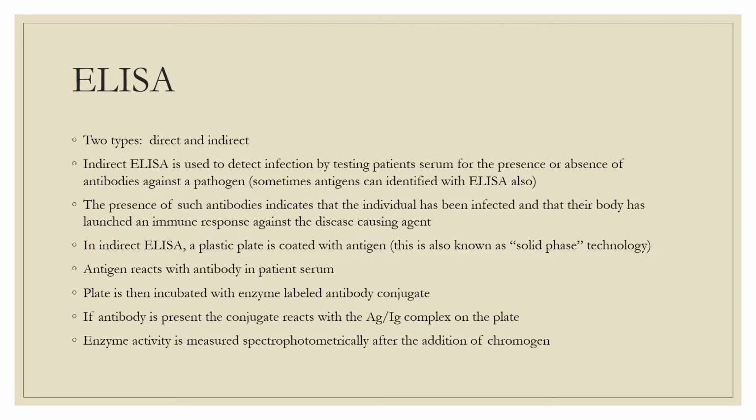Next, an enzyme-labeled antibody specific to that conjugate is added. Finally, a chromogenic substrate is added, which changes color in the presence of the enzyme. A lot of times that color is yellow, and you can see that with the naked eye. The amount of color that develops is proportional to the amount of antigen in the patient's specimen. Now, we can also detect antibodies. There are 3 types of methods for antibody detection called non-competitive, competitive, and capture antibody detection.